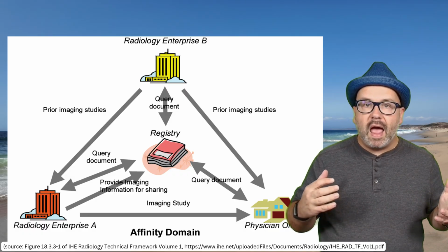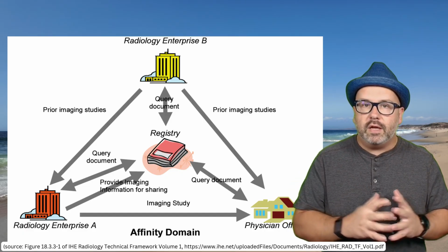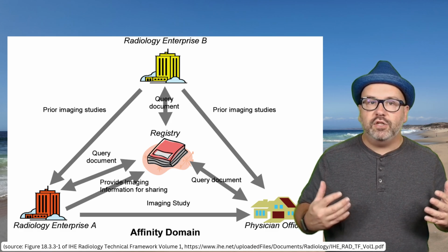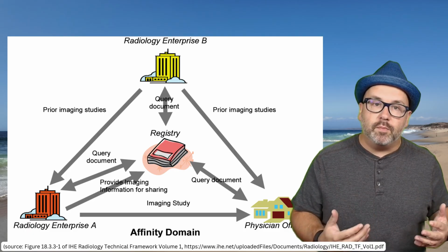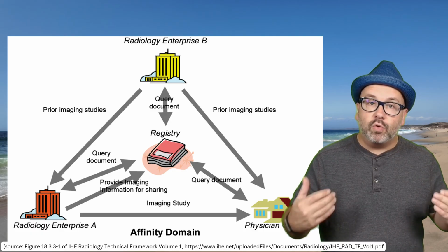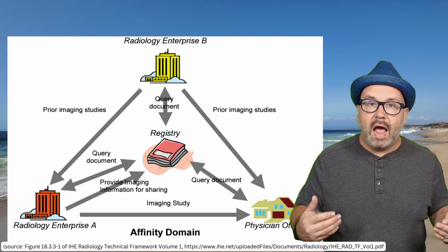And it works by having a centralized registry. It could be at one of the sites or in a central location where we publish references that these individual hospitals have imaging for my patients. I can then query and see what's available and then talk to the individual repositories and the image managers behind that to be able to retrieve the imaging and related metadata. Let's take a deep dive in how it works.